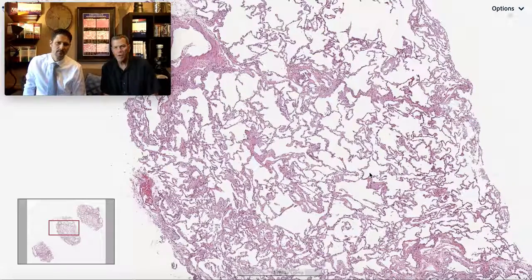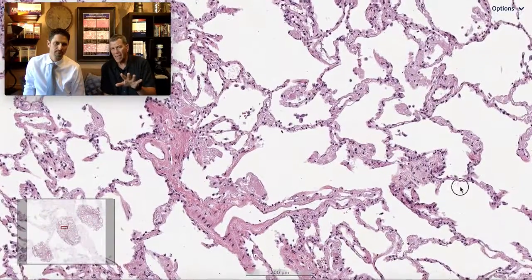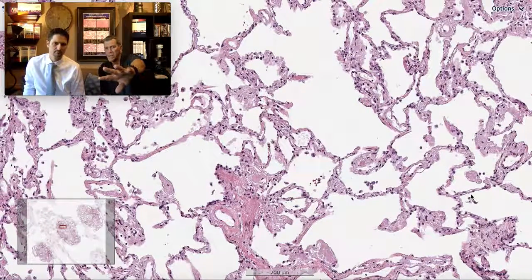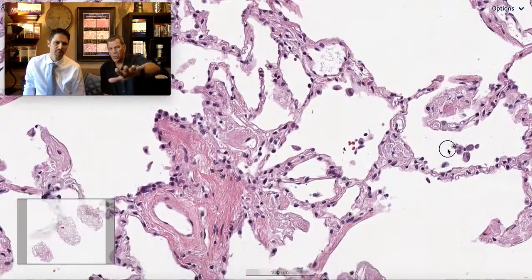For a general NSIP category, that's one of the most challenging concepts for people to understand — NSIP, although we describe it as a diffuse homogeneous process, when you look at it from low power it often looks heterogeneous. It's variable in the amount of interstitial inflammatory infiltrate or fibrosis. I like to think of NSIP as having a pervasive influence on the interstitium — there's something in this interstitium that doesn't belong here and there's too much of it.